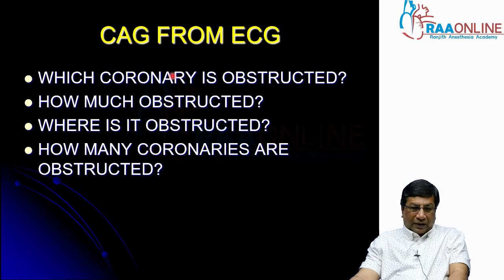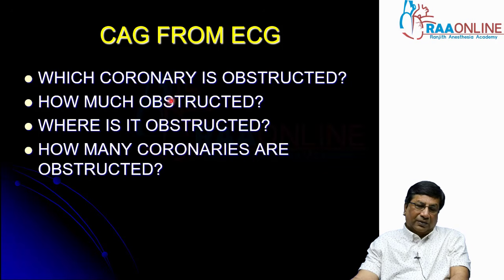So now we have located which coronary artery is obstructed. In acute occlusion, we also know whether it is a critical occlusion due to white thrombus or a total occlusion due to red thrombus. The management is completely different for these two types of obstruction.